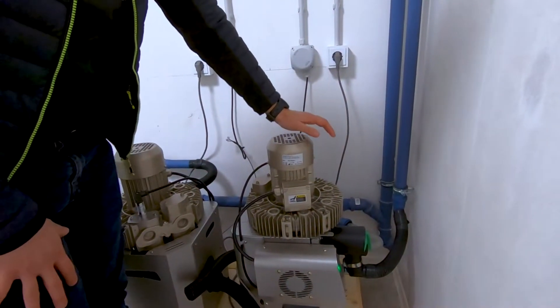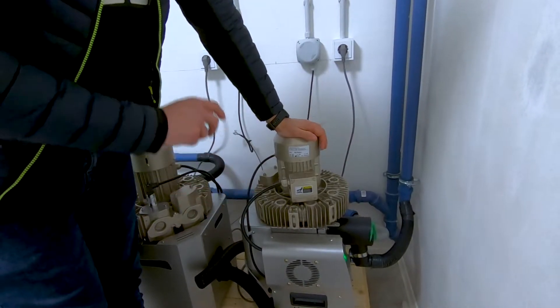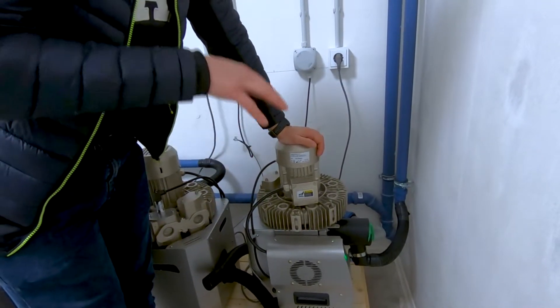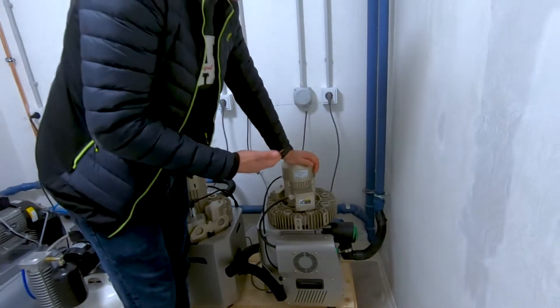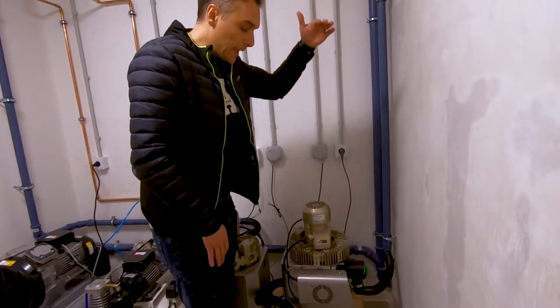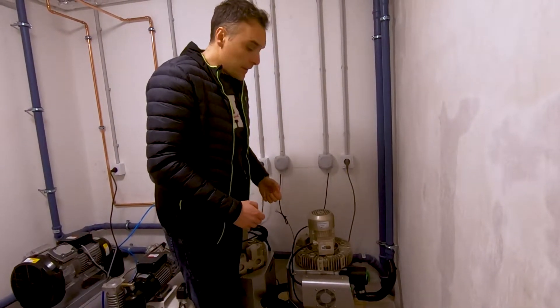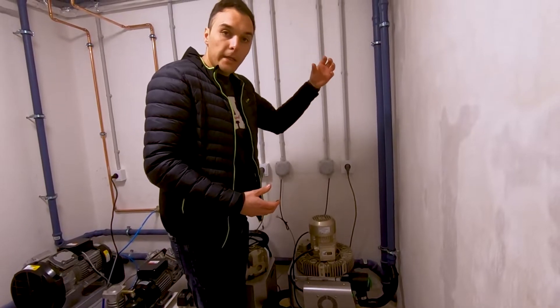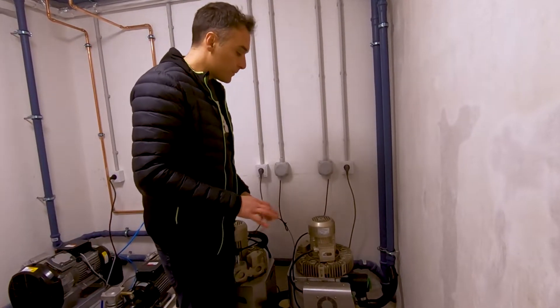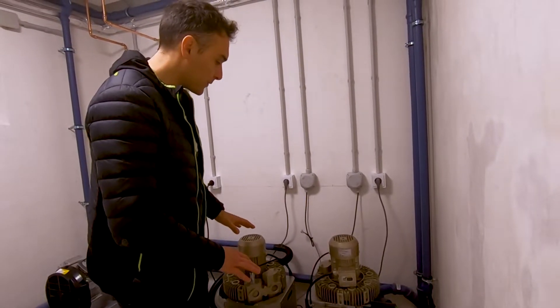In case we didn't have space on the same level as the dental unit or in the basement, and we had to place the suction motor one level above the clinic, then we would need to apply a dry suction system that takes only air into the motor. But that's not the case here, so we have two wet suction systems.